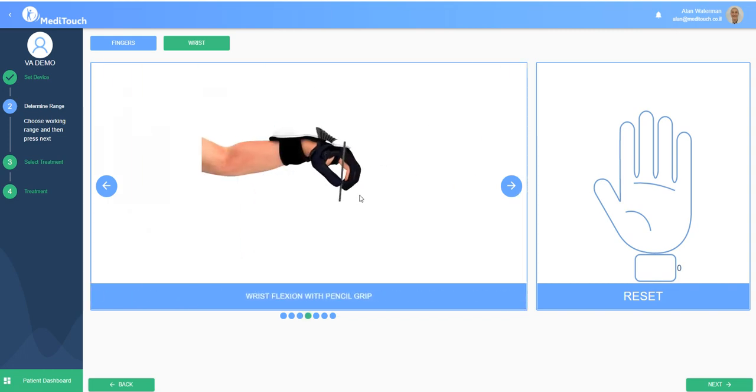Here, this is interesting. Obviously this is a radial and ulnar deviation, and functionally we're gripping the pen. So here we can see that we're using the hand tutor. The hand tutor is wrist flexion and extension. If we do that maneuver, actually doing some work with the pen, we're practicing the task of holding or gripping the pen, but also we're picking up that movement as we're doing flexion and extension.